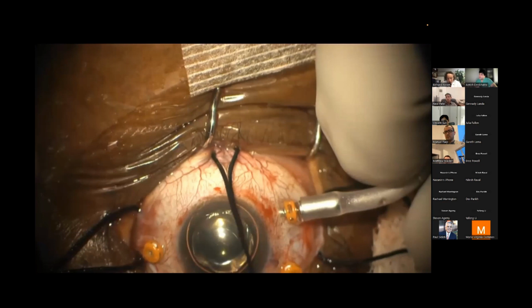Another thought is, if you're right at the edge of the buckle, sometimes if you can go a little bit higher, just pull up the buckle slightly, that will catch it on the posterior edge of the elevation without having to move the element.